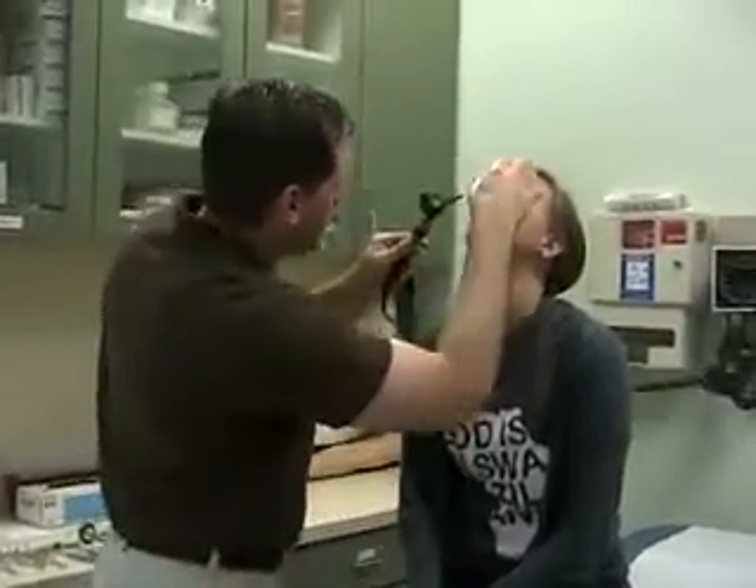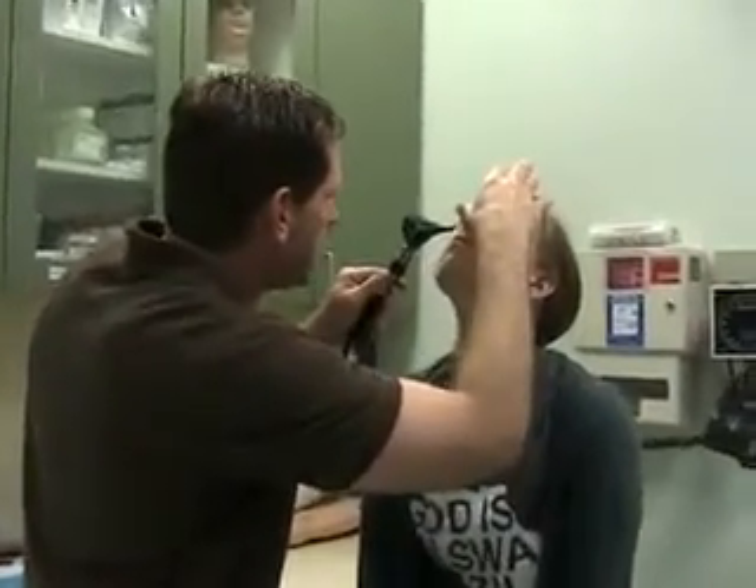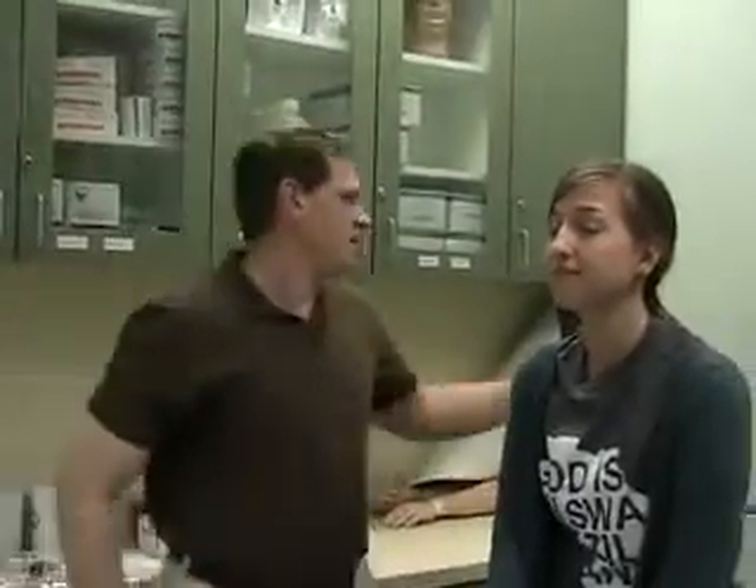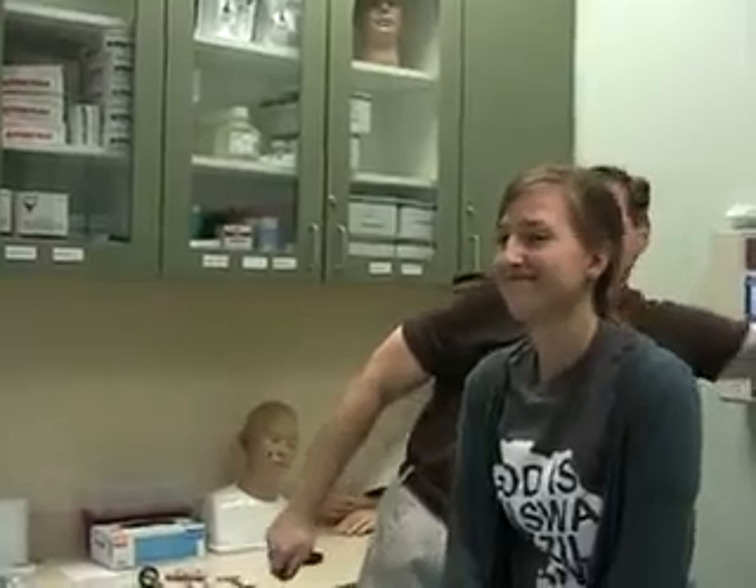Check the other ear. We're going to leave the otoscope on because the next thing we're going to do is look up their nose. So have them look up at the ceiling, open their nose, and look inside. You can also look through the otoscope if you want to get a slightly magnified view of their nose. Then take the speculum off and put the otoscope down for a moment.